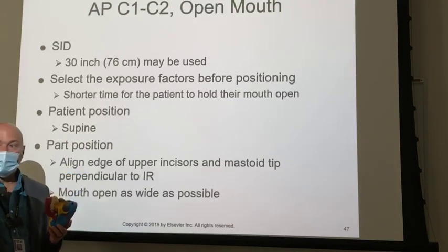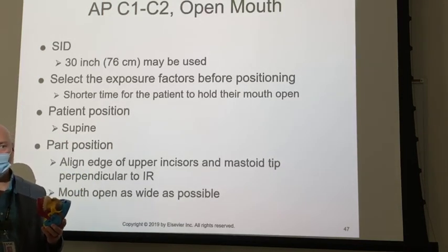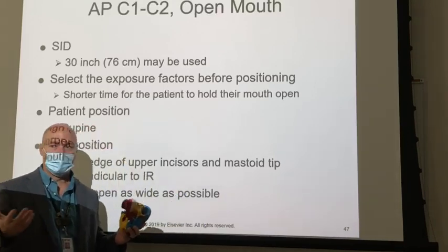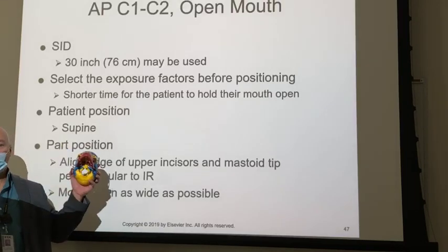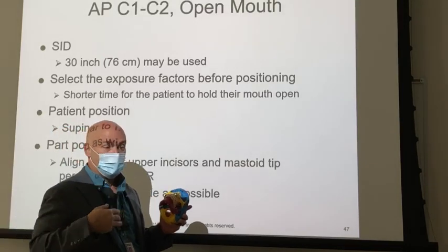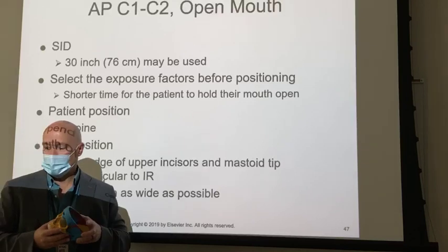If it's a trauma situation, ER patient, and they say 2 view of the C-spine, it's really 3 view. Every time it's 3 view. Most of your hospitals are probably going to say 3 view, but if it does not, then, you know, if your order says 2 view C-spine, it's going to be a 3 view C-spine. The open mouth completes the AP. You only saw from C3 down on the AP axial, so the open mouth completes the AP, all right?